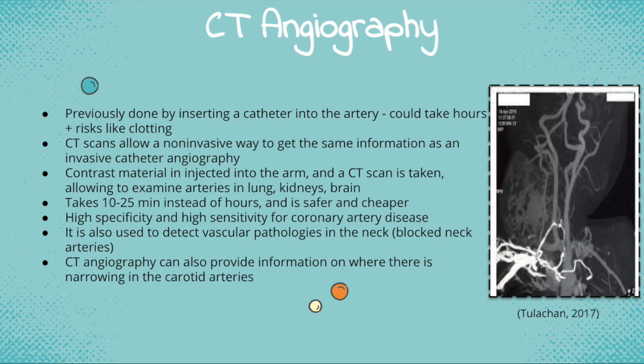Angiography is another advancement in diagnostic CT. Just a few years ago, an angiography, which is an examination of the blood vessels, could only be done by inserting a catheter into an artery. This procedure had use of contrast and could take up to several hours, and it would often require a sedative. It also had risks involved like blood clots or bleeding.